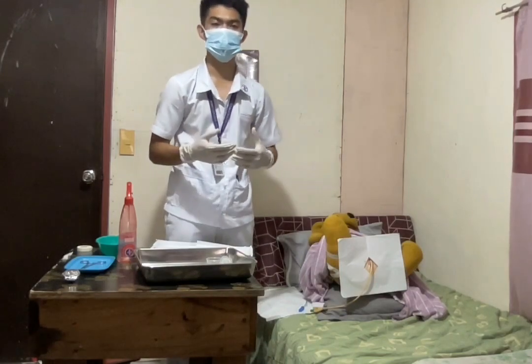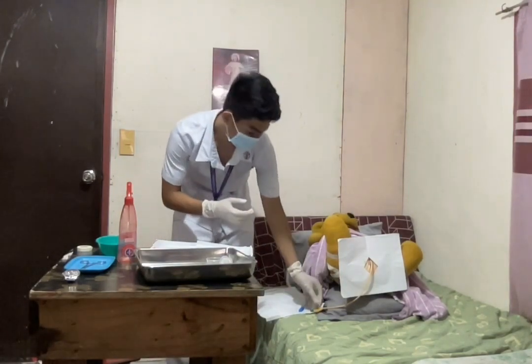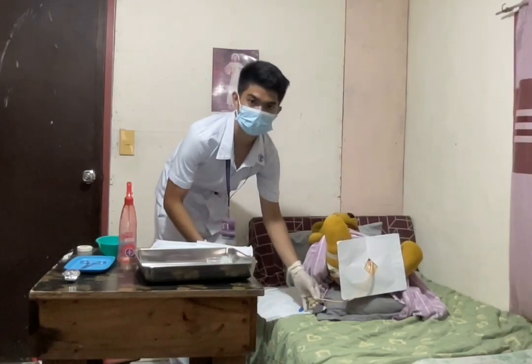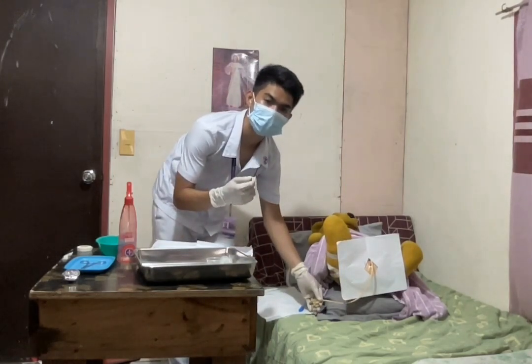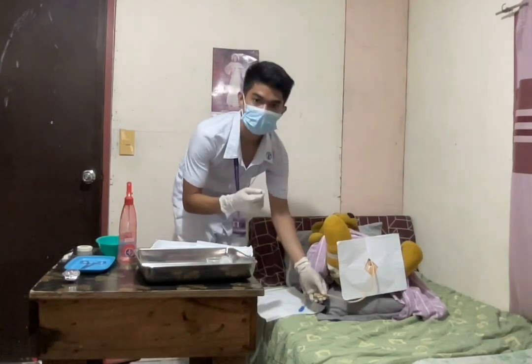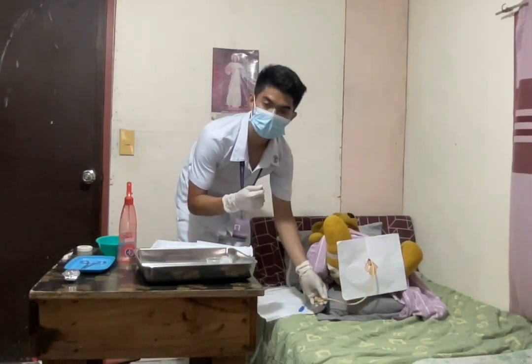Next, I'm going to rest the hand on the pubis area while holding the catheter in place to prevent pulling and pushing of the catheter. This is to prevent accidental displacement of the catheter while ensuring the patient's comfort. Next, I'm going to connect the catheter to the urine bag.